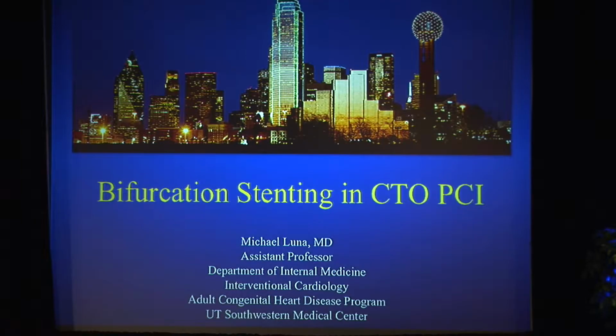I'm not actually going to talk about all complex angiographic subsets. It's too much to cover in 10 minutes. So I'm going to focus on one particular complex situation regarding CTO-PCI. So we'll start with a case.